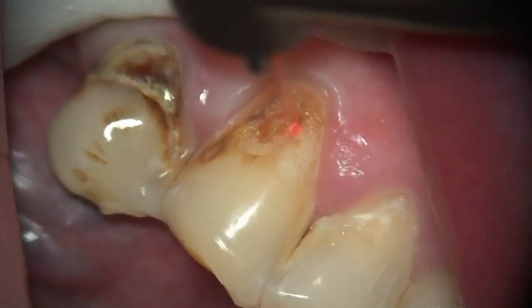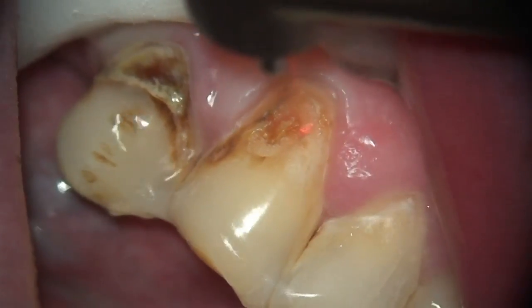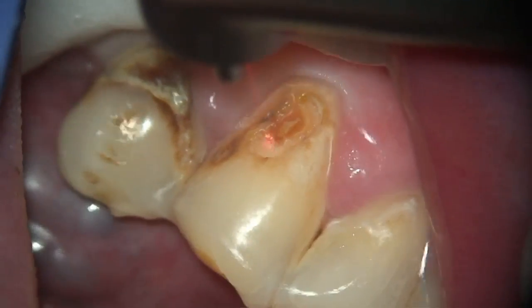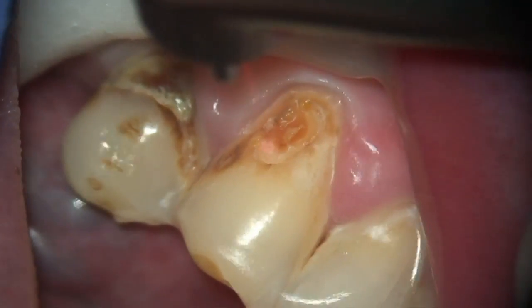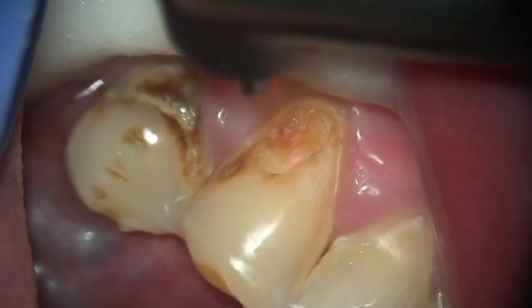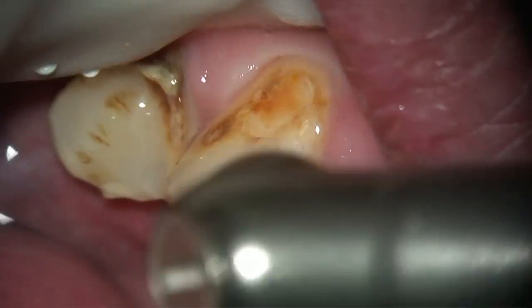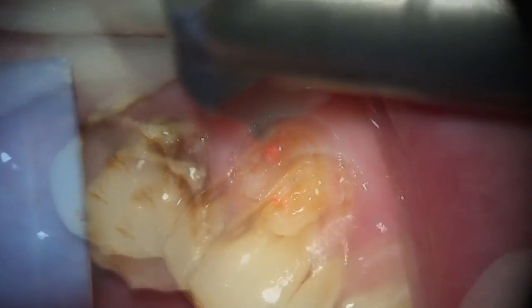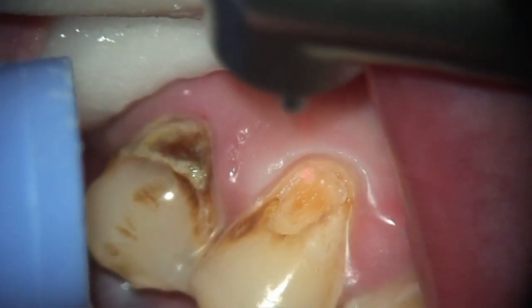I can change the setting on the laser to 50, which is a very short microsecond pulse duration. It allows me to use very low energies. It doesn't allow the nerves in the tooth to fire, so I can actually prepare and remove decalcified and decayed tooth structure in an area that would normally be quite sensitive for the patient. They feel a cool or cold sensation rather than heat.